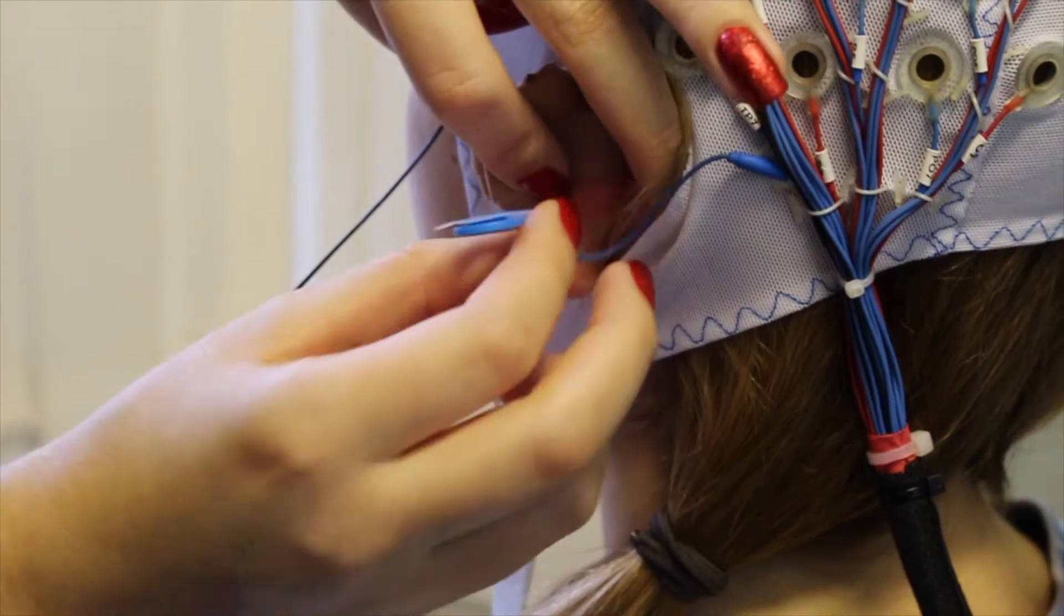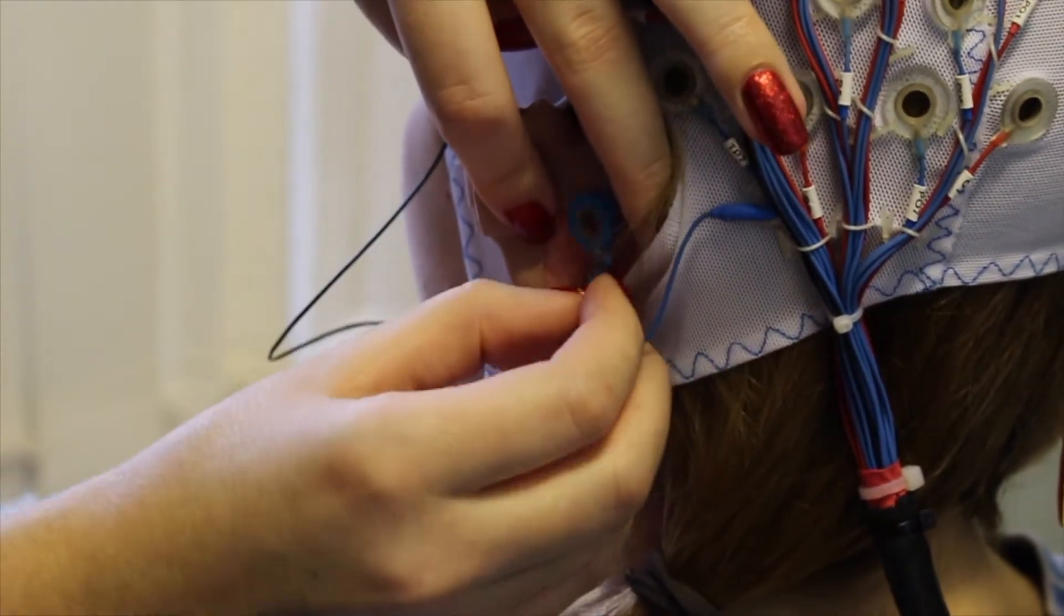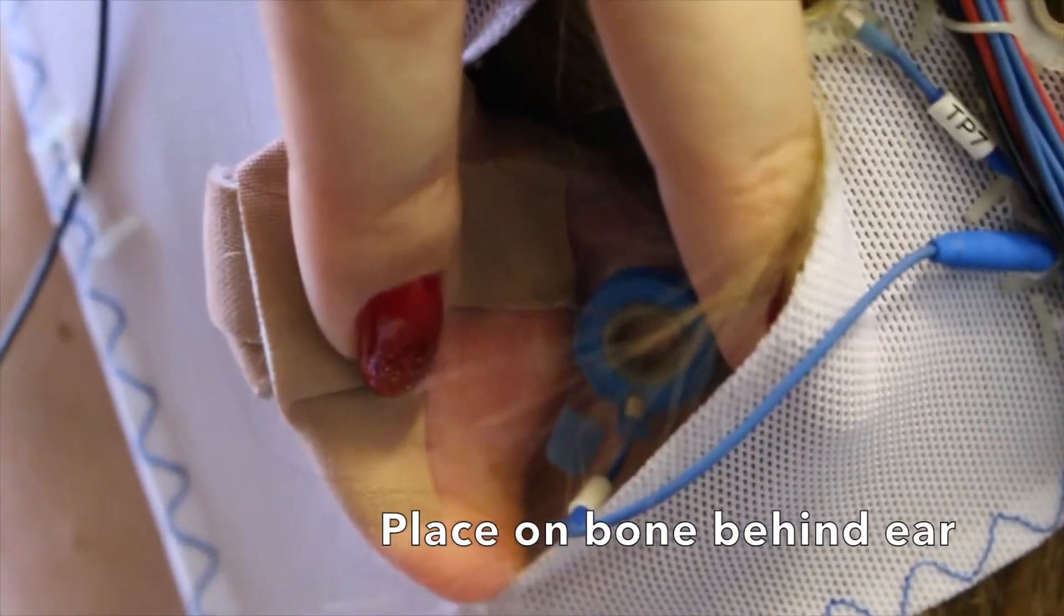Check with your participant that none of the electrodes are irritating them, as this will prevent them trying to touch them during the experiment.